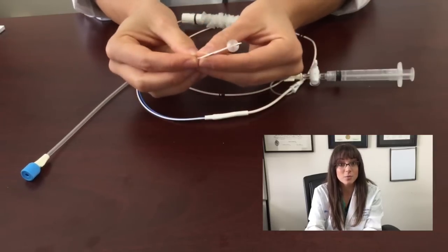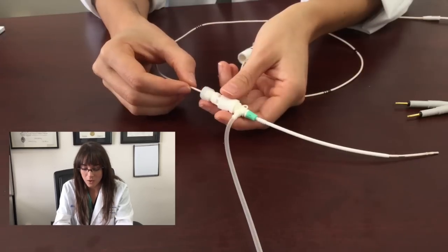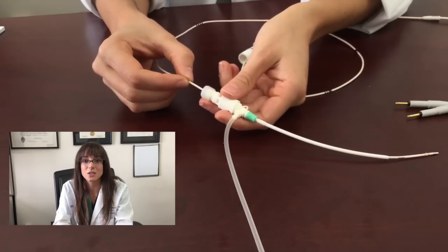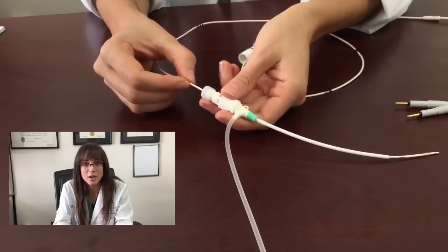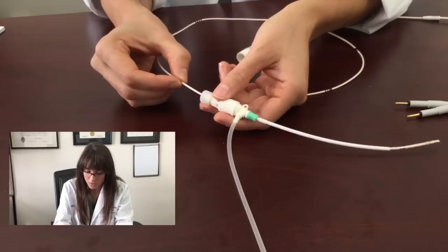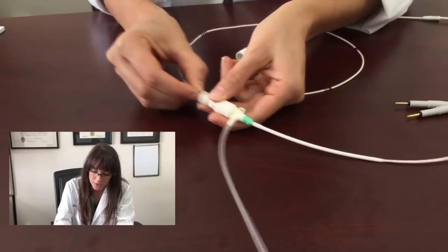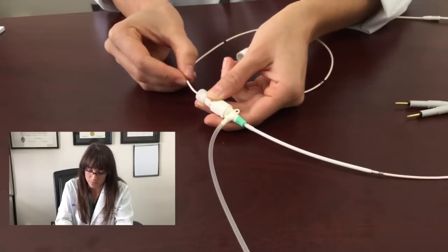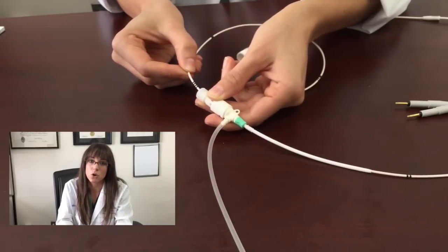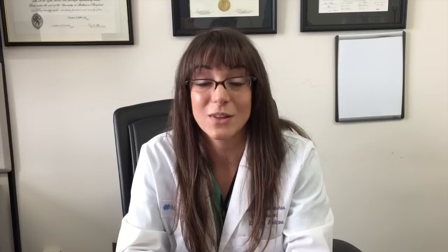Now sterile me can go on and place the pacemaker. With the balloon up, we are going to advance the pacemaker wire until we get capture. By capture, what I mean is you're going to see on the patient monitor large rhythmic QRS complexes going at the rate that you had set the box at. We're going to advance the pacemaker wire with decisive movements until we get capture. Usually you will not have to go beyond the four mark.